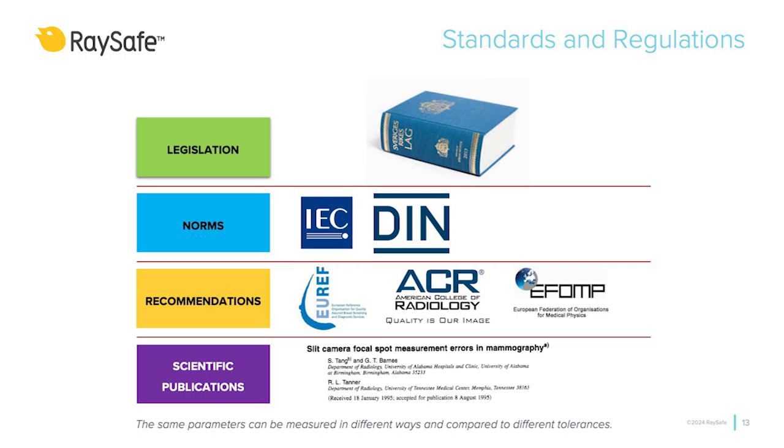They cover aspects like phantom types for different tests, testing frequency, and acceptable performance ranges. Additionally, these recommendations provide best practices for QA programs, including guidance on documenting and evaluating phantom test results. By following these norms, we ensure high standards of image quality, which are crucial for accurate diagnosis and optimal patient care.